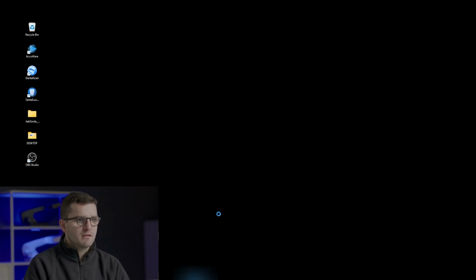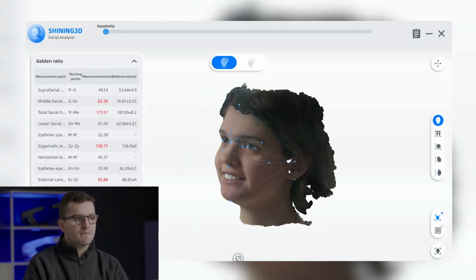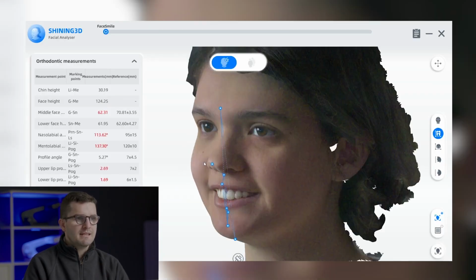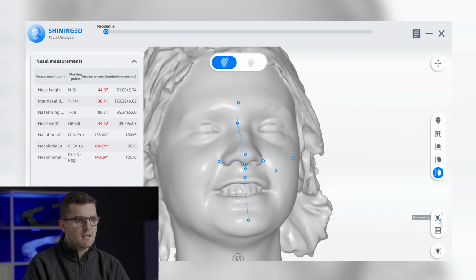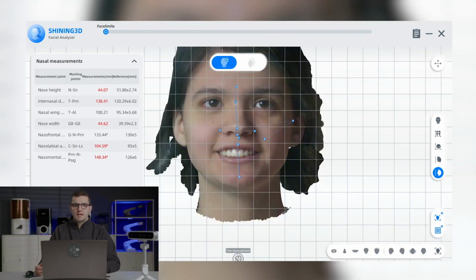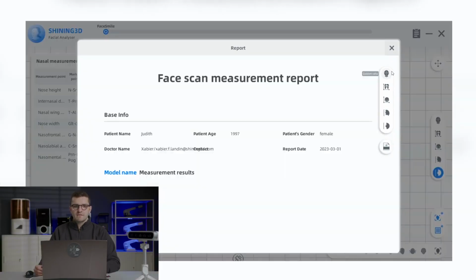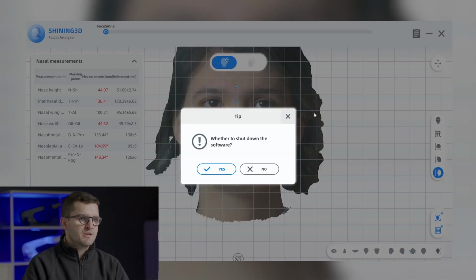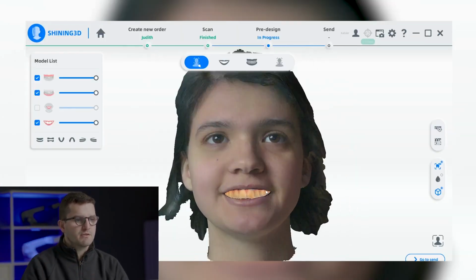The last module in our software is responsible for measuring the most crucial data from the scan data. It can measure the distance of facial data and compare facial changes before and after treatment. These software tools aid dentists in diagnosis and evaluating treatment more effectively, while also improving patient satisfaction with the treatment plan by adding visual presentation.